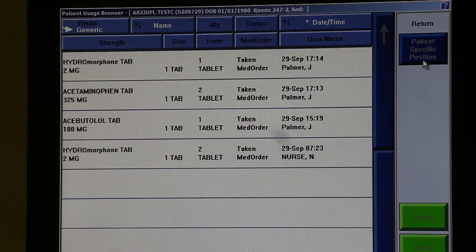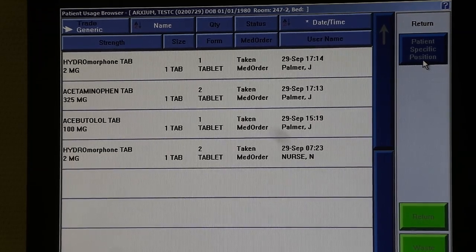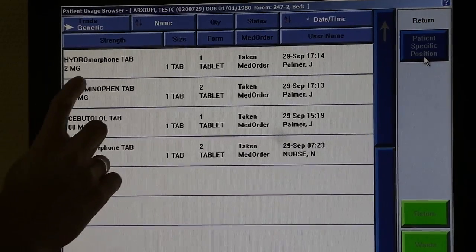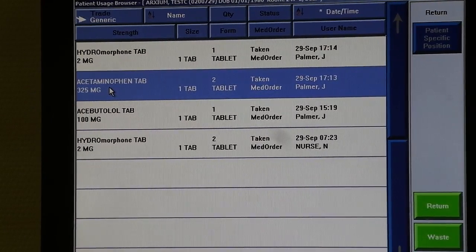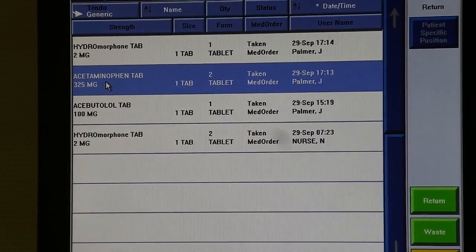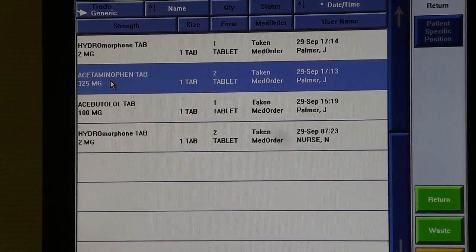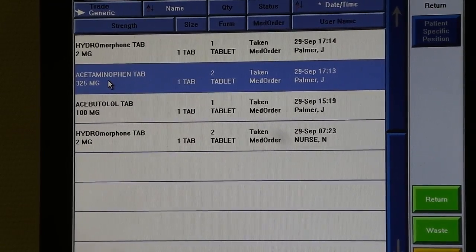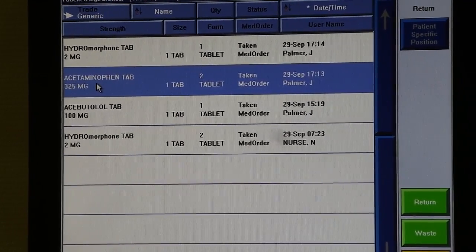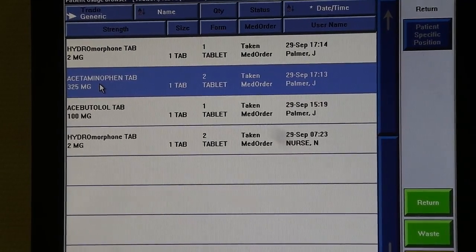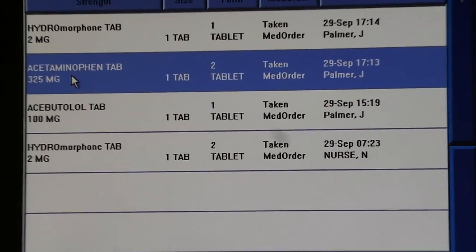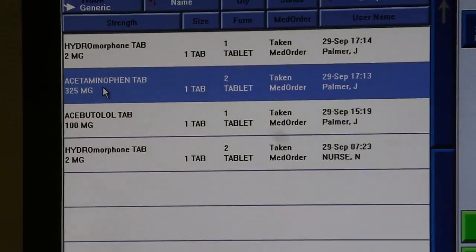In this case I'm going to show you a return on an acetaminophen. In this case we dispensed two tablets for this patient, but let's say we went to dispense medication to the patient and they said they only wanted one dose. They refused the second tablet.